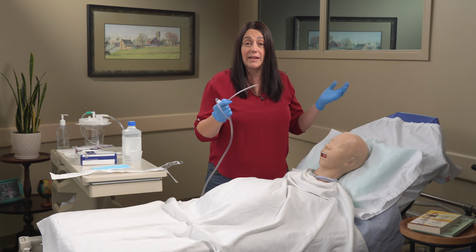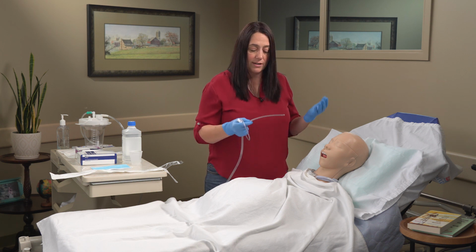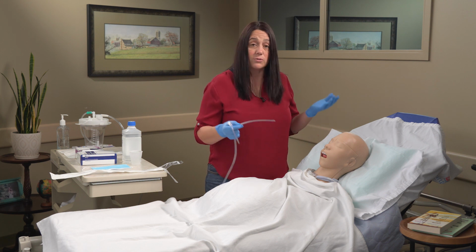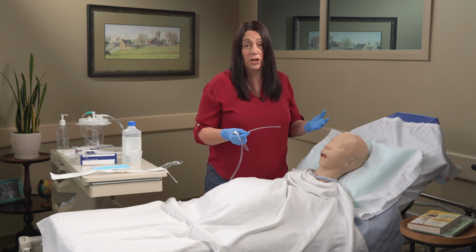I'm going to let the patient know what I'm doing. Okay, Jim, I'm going to suction you now. I won't be doing it for any longer than 10 seconds. And then I'm going to give you a break in between if we need to suction again. So he's aware of what we're doing.